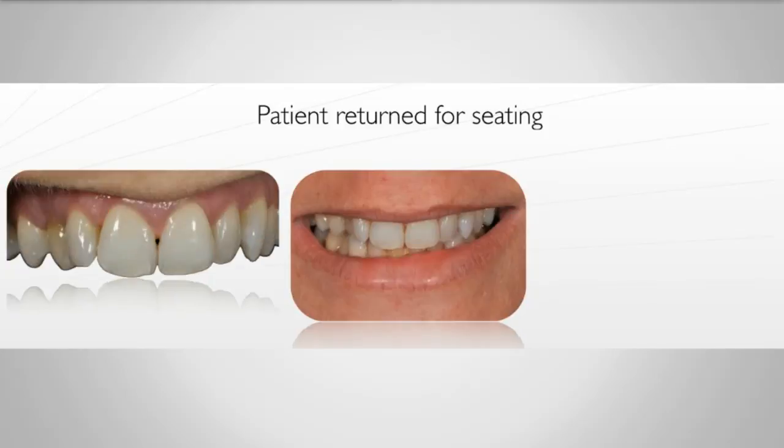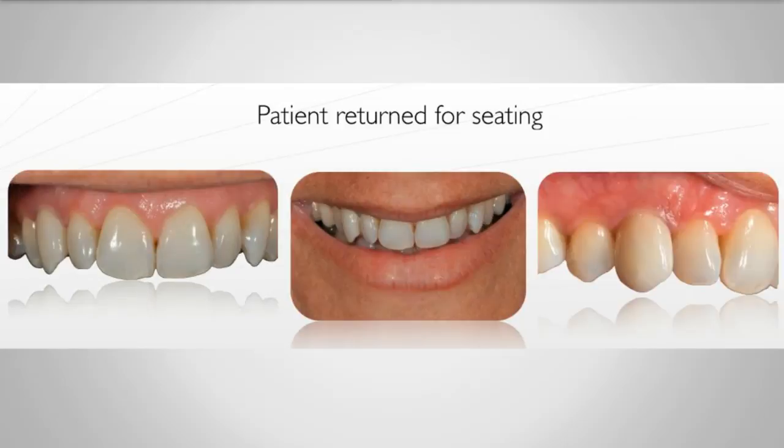Here's what she looked like prior to restoration. Here we are immediately after seating it. And here's her smile, retracted view. This is probably after 10 minutes. Maybe when I first put it in, a little bit of blanching, but it looks really healthy immediately.